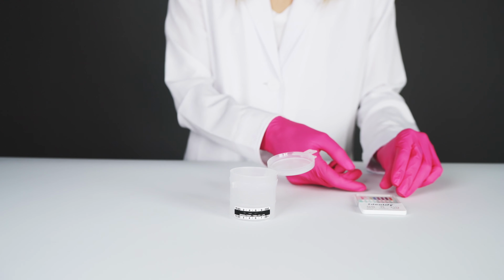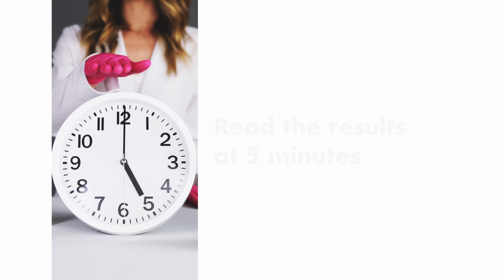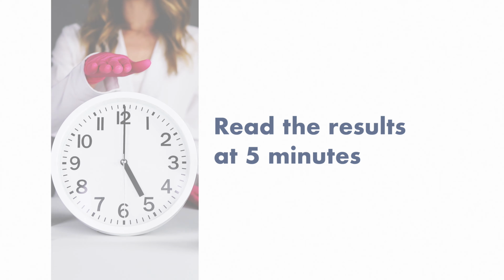Place the dip card on a flat surface. Start the timer and wait for the colored lines to appear. Read the results at 5 minutes.